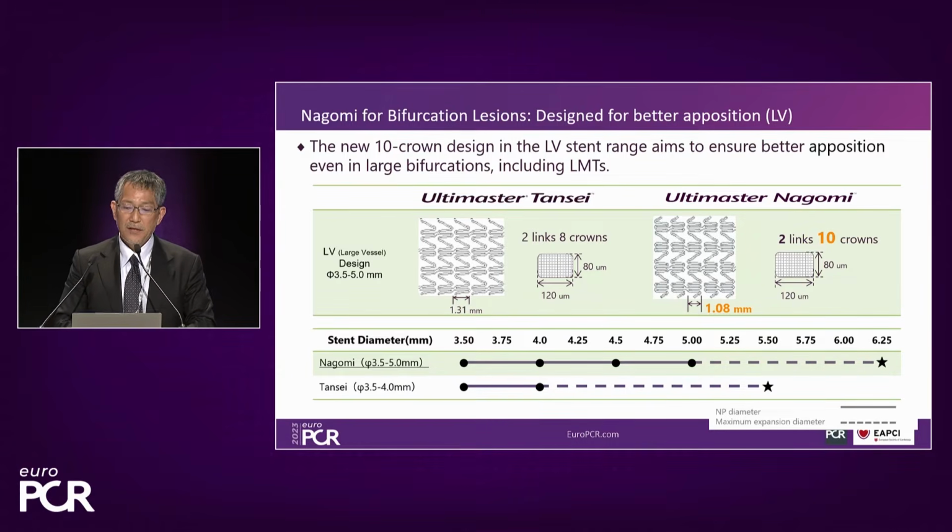So it means this change improved not only the expansion of the stent itself, but also the expansion capacity of the cells.